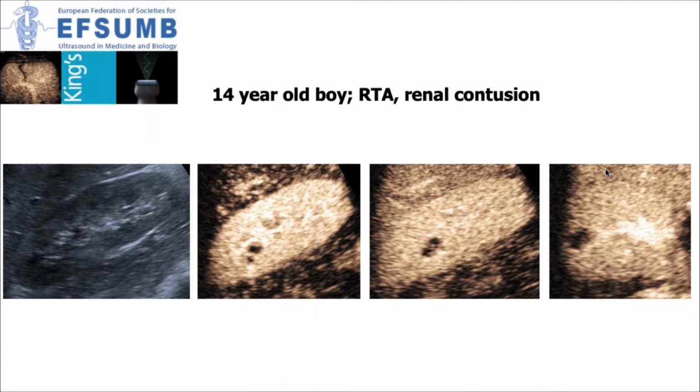The majority of patients will not show any trauma, any injury. However, there may be one or two that show a small subtle contusion that may require further imaging, because of course contrast-enhanced ultrasound cannot assess the collecting system as it is a purely intravascular agent. That said, the majority of these cases you will want to discharge as benign and no further follow-up needed. So that's where contrast-enhanced ultrasound, I think, is very useful in the pediatric low-impact traumas.